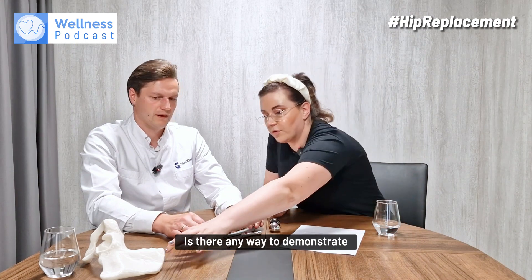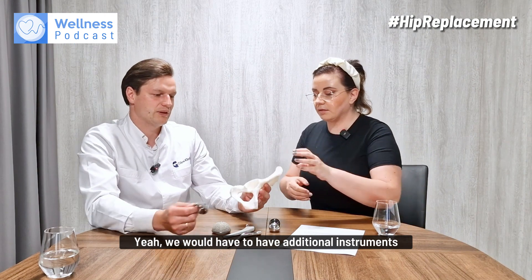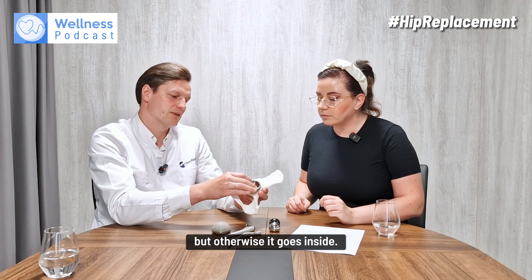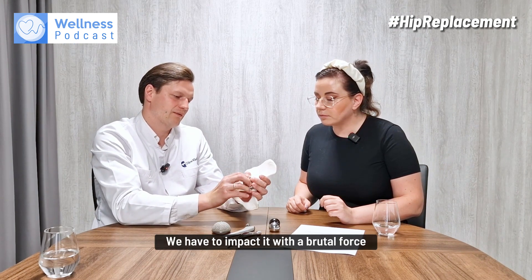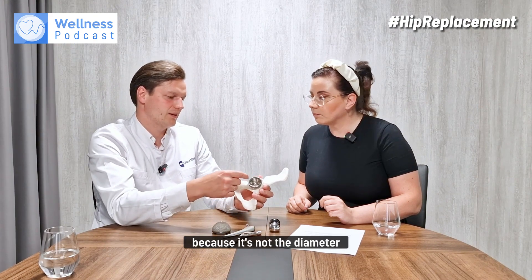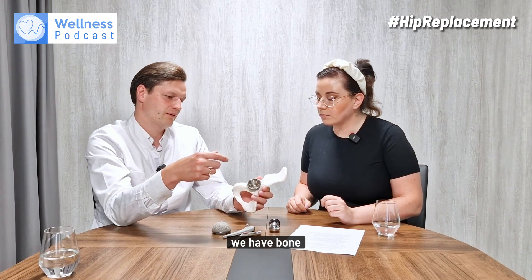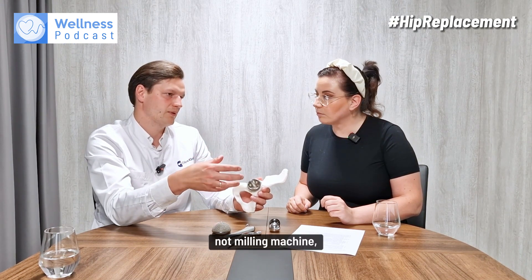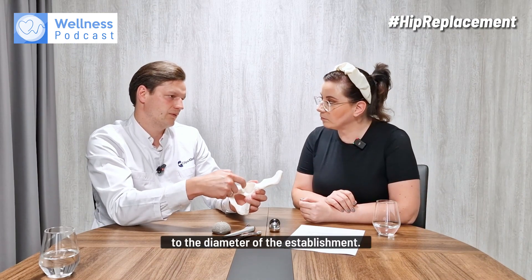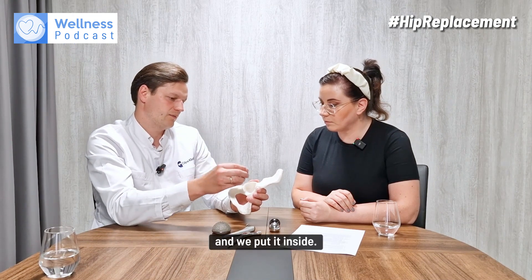To demonstrate how this works: we would need additional instruments to ream the acetabulum from the outside, but otherwise the cup goes inside. We have to impact it with quite a brutal force. It's not fitting here because this is not the diameter that matches the acetabulum. We use a reaming machine — we ream the bone to the correct diameter, and when we see it's enough, we take the exact size and put it inside.